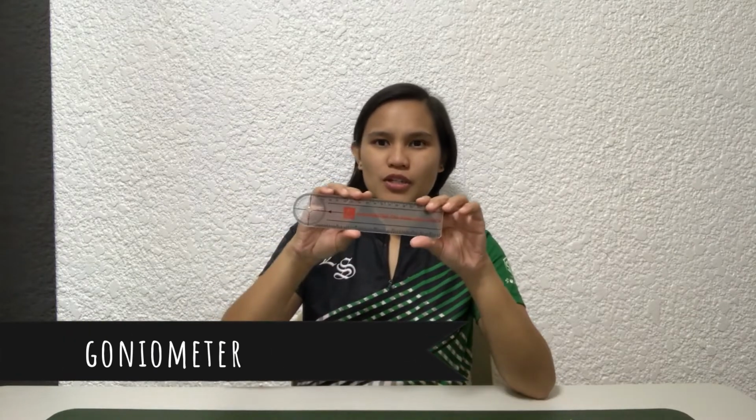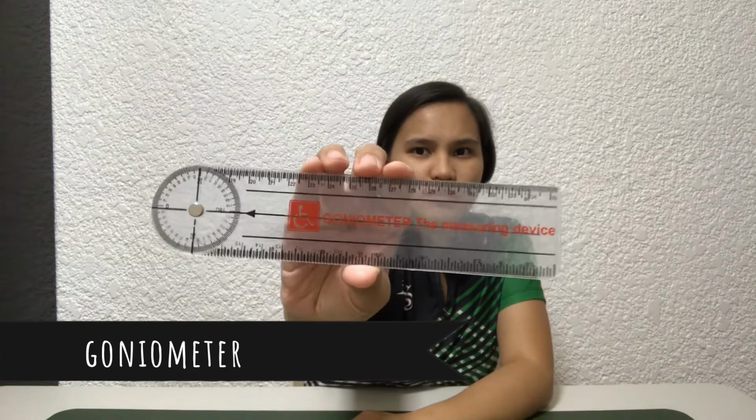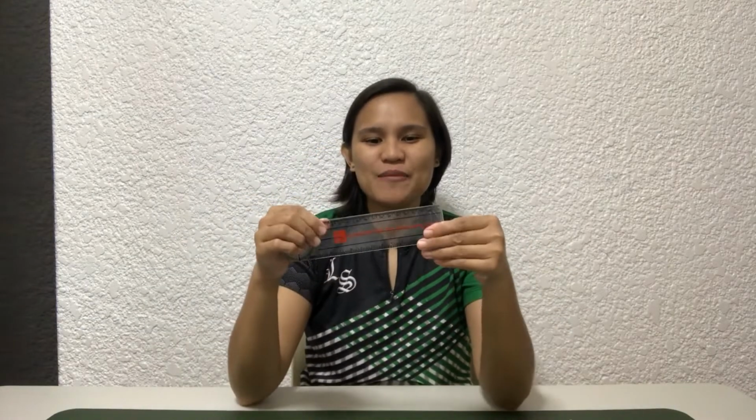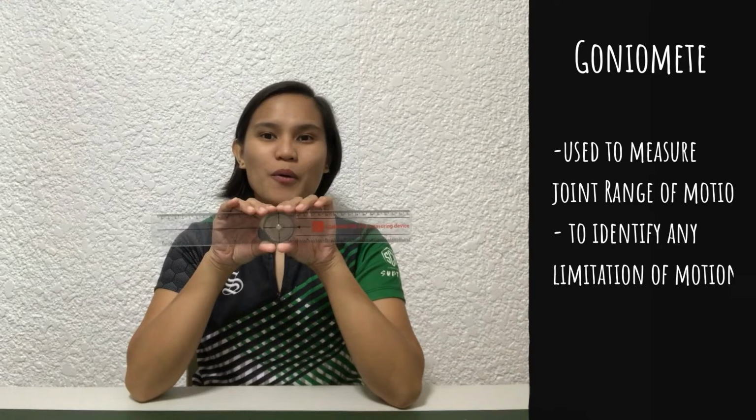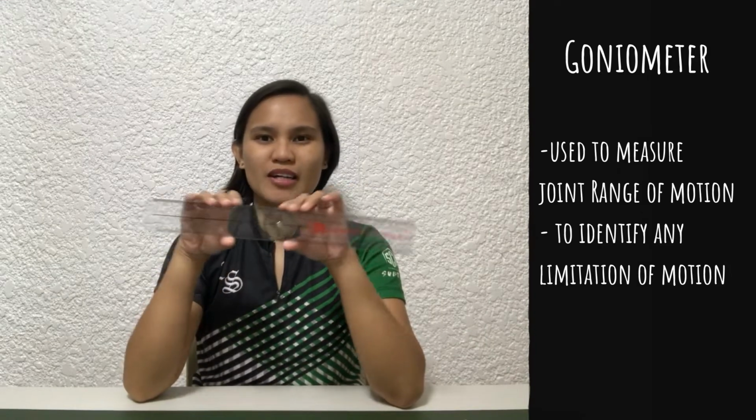Now, specifically for physical therapists, what I have here is called the goniometer, alright? So, if you could see here, the goniometer is like a ruler with a protractor in one. So, where do we use the goniometer? We use the goniometer to measure the range of motion of our patients. So, what do we mean by range of motion?